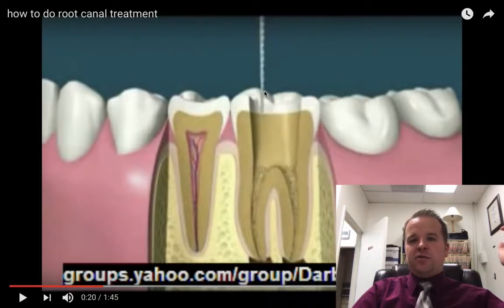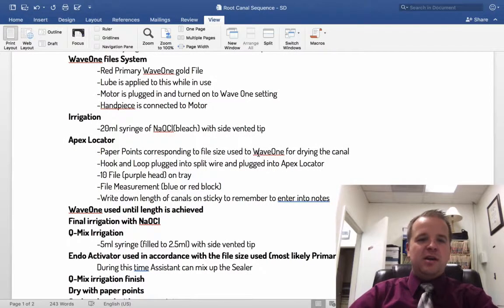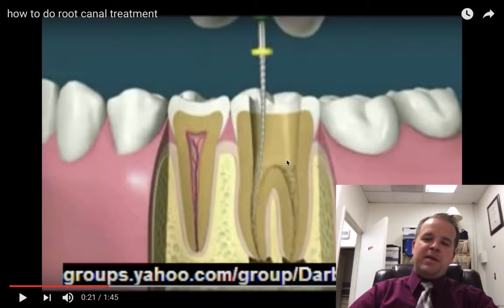Essentially what you're trying to do is get this file all the way down to the very end of the root, and then get the bleach all the way down to the very end of the root, so that it can clean it out and make sure everything's good to go. One of the instruments that you'll use once you start getting everything bleached out and clean will do about 80% of the work. So the dentist will go down to about right here, gently going down all the way, and then he'll clean it out.